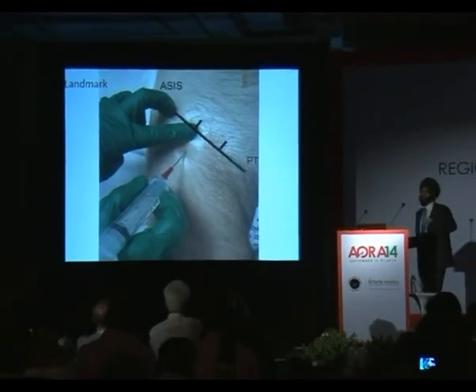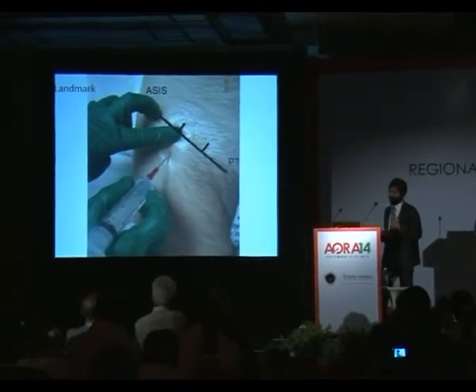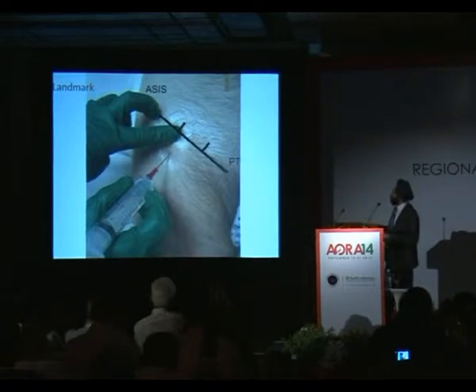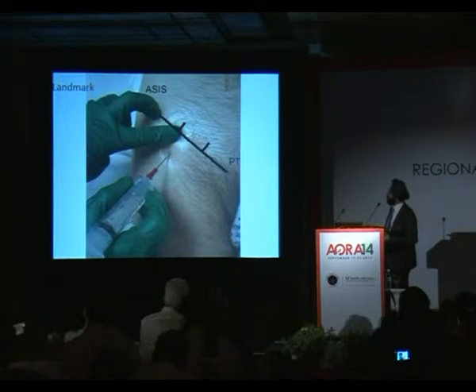It also helps in retracting the skin. The needle insertion point is about one finger, so about 1 to 2 centimeters caudal to that point. You can use a 22-gauge needle, or if you do have one, a short bevel regional anesthesia needle. What we need to do is infiltrate some local anesthetic.